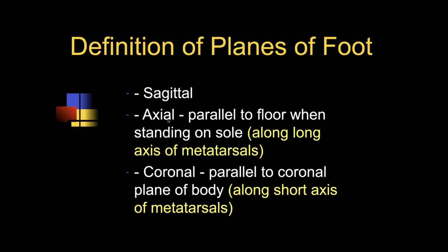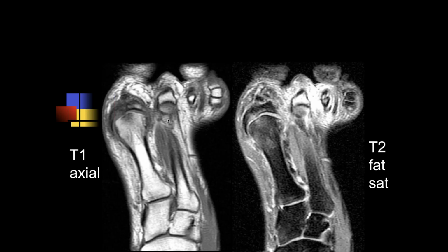So anyway, it's still a problem, and I still see a lot of radiologists using inappropriate terminology here, but I just want everybody to be aware of that. Okay. So this would be the axial plane, whereas a lot of radiologists would call it the coronal plane.